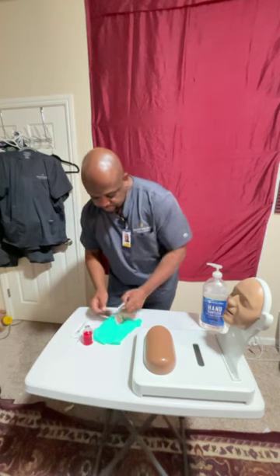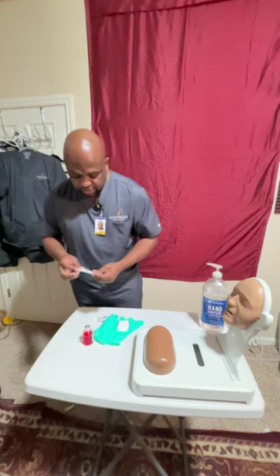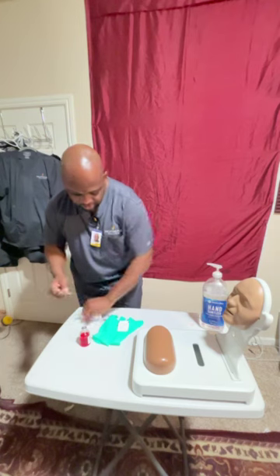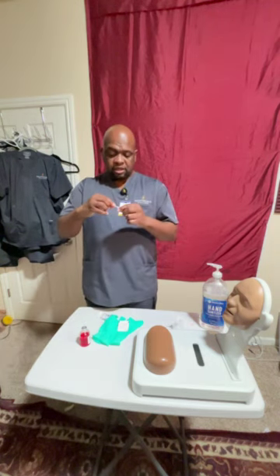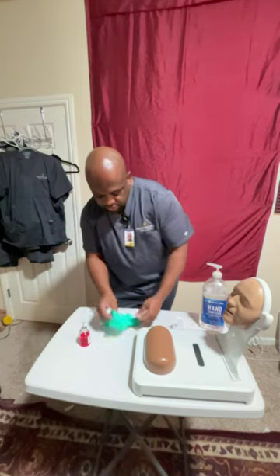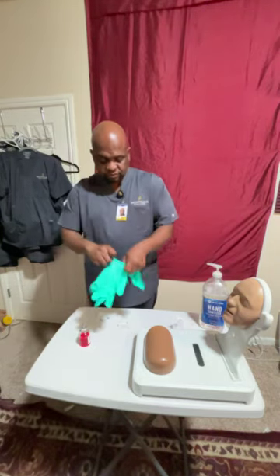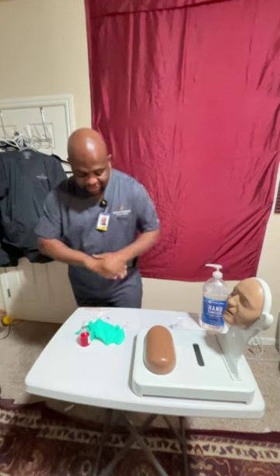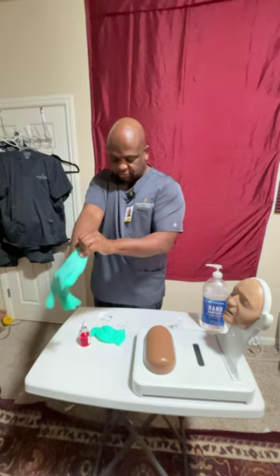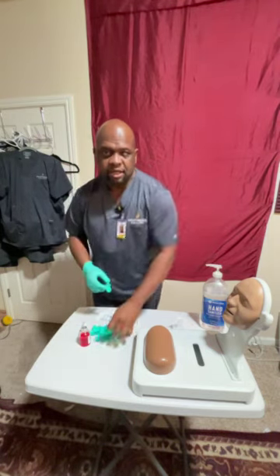There we are. Let's take the needle out. And let's put this one here. And I'm going to put that one there and twist that on, secure, that's on. Now, let's put my gloves on. Let's do hand hygiene again. Although I did hand hygiene right before, maybe I'm just being a little too cautious here. I just did hand hygiene. Yeah, so I'll go ahead and put those gloves on.